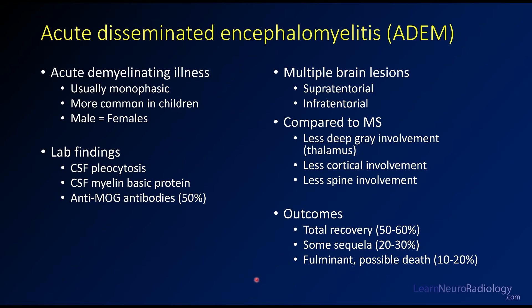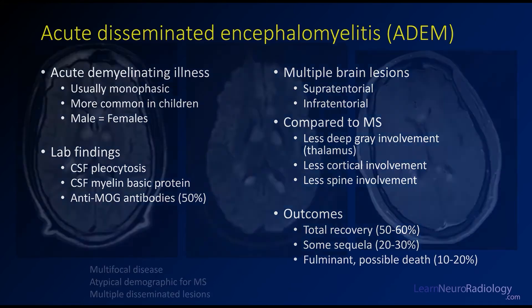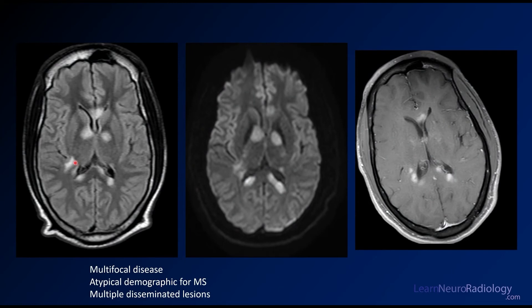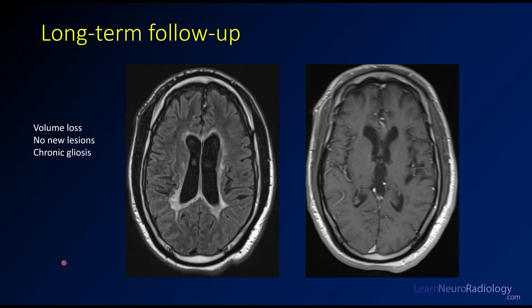Death is even possible in some patients if it proceeds to a fulminant stage. Looking at the same case again, you see FLAIR abnormalities in the basal ganglia and corpus callosum with abnormal diffusion and enhancement. This could be MS, but it's pretty fulminant because you have a lot of enhancing lesions. It's also an atypical demographic — a younger person. On long-term follow-up, this patient has volume loss, no new lesions, but chronic gliosis. The ventricles are too large and the white matter around the ventricles is pretty gliotic — T2 bright — but no enhancement at this point.